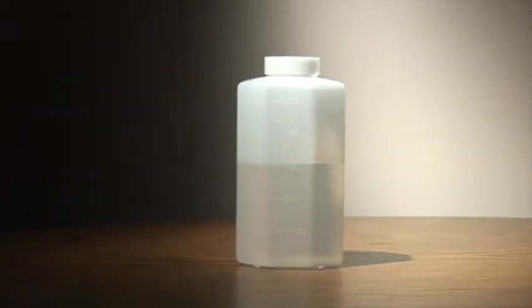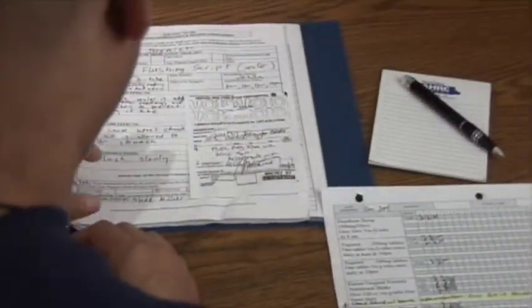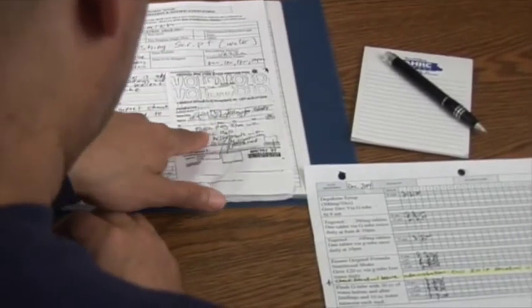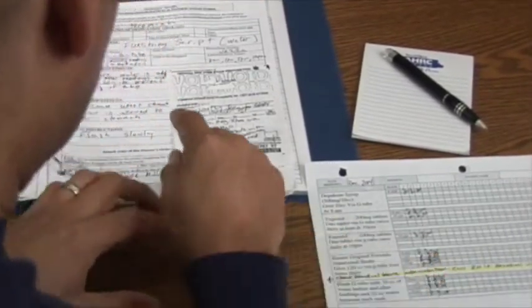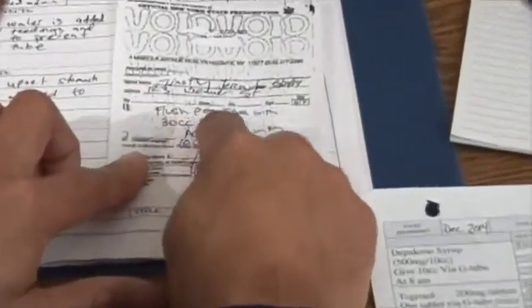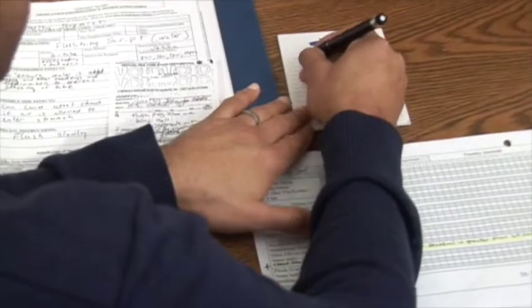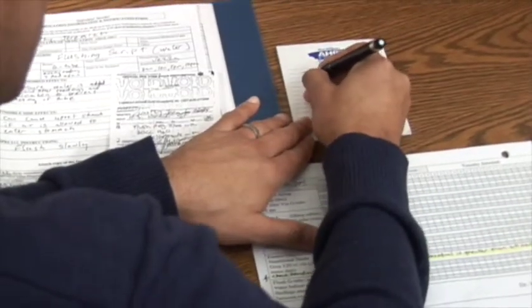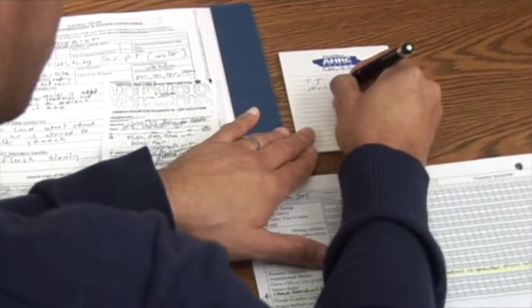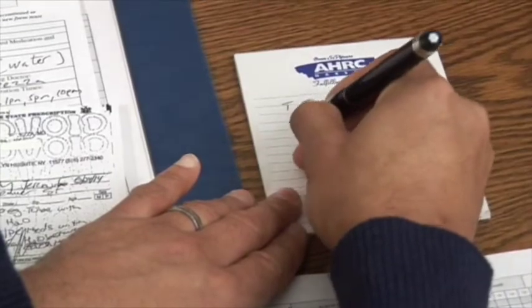Check the doctor's orders for the amount of water to be flushed before and after each med. I need to find out how much fluids I'm going to use between the meds. Flush the PEG tube with 30 cc's between meals and 10 cc's between each medication. I'm going to write it down so I don't forget: 10 cc's of water between each med.